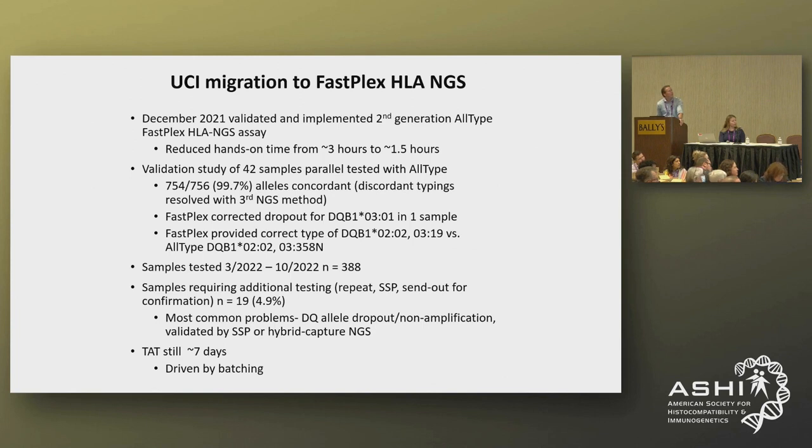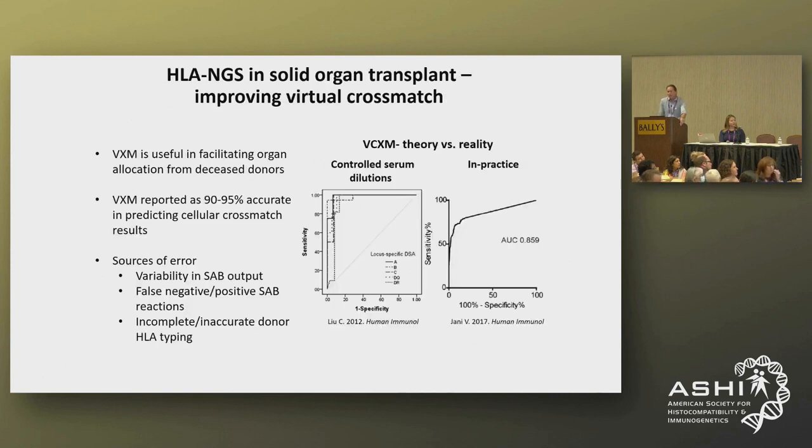We did a validation study, and the validation study performed extremely well. We've tested about 400 samples using this approach. We're still seeing that about 5% of samples require additional testing, and again, the most common problem is still dropout.